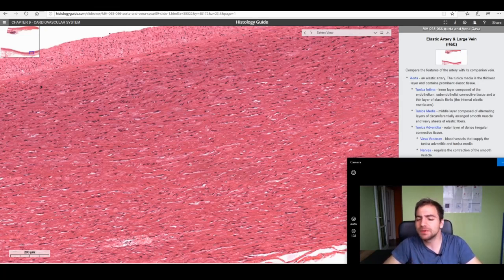The smooth muscle cell typically has a contractile function, not that of production. But in this case, in the aorta, we can see that these smooth muscles also produce these elastic fibers. The purpose of this is to allow the diameter to go back to its original size, because of course we have the blood coming out of the heart with high pressure, and whenever we have a volume pressing through an area, there's a tendency to distend the vessel and the artery.